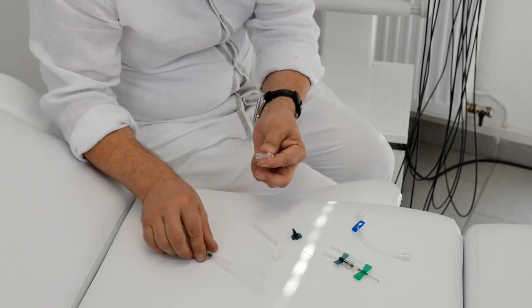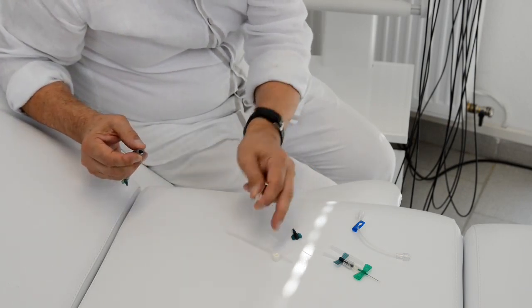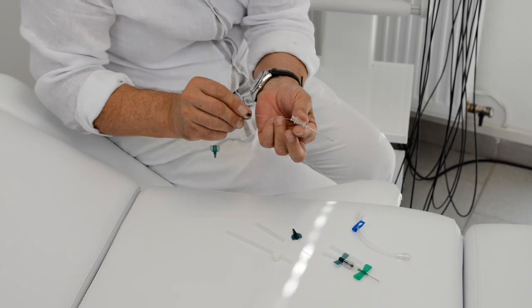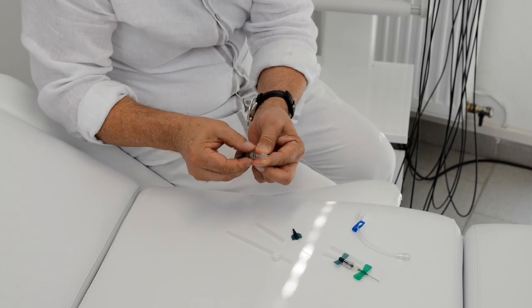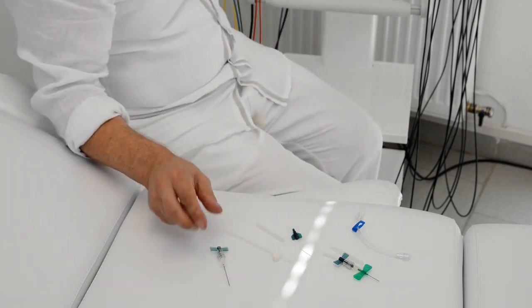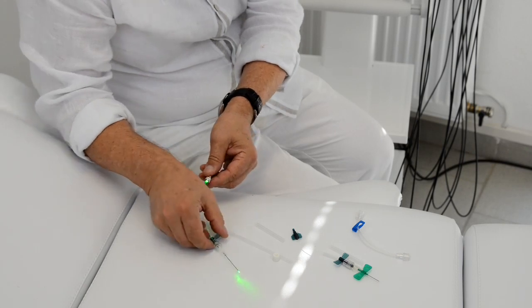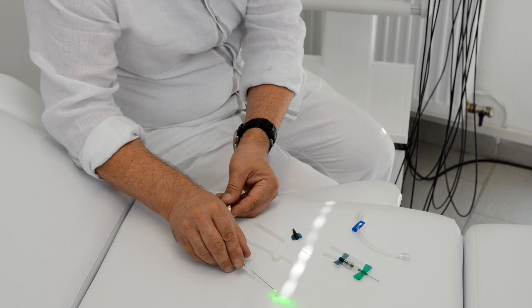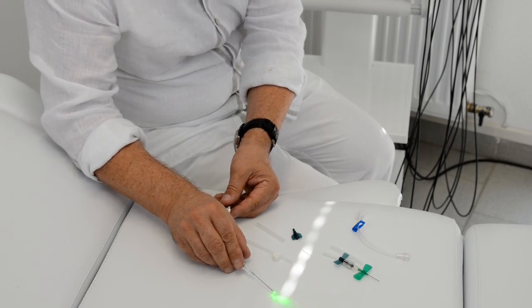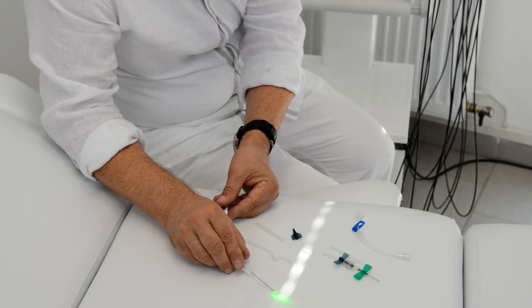of 4 centimeters. And once it's inserted in the tissue or in the joint, I will put in my laser catheter, fix it by screwing, and then I can connect it again to the laser, and then you see the light is coming out in a pure form directly into the body wherever it is used, in a joint, the spine, or maybe used for photodynamic treatment for destruction of tumors.